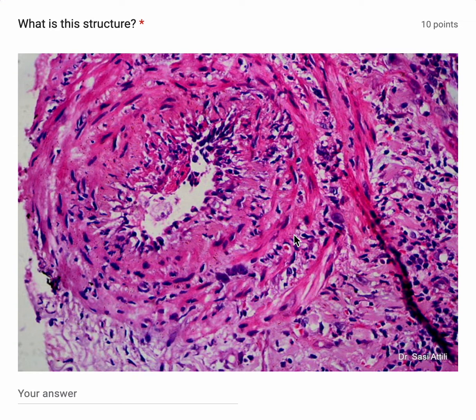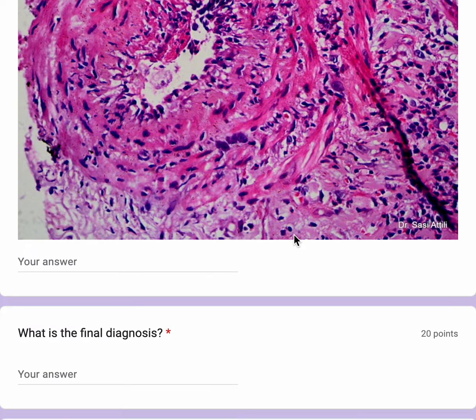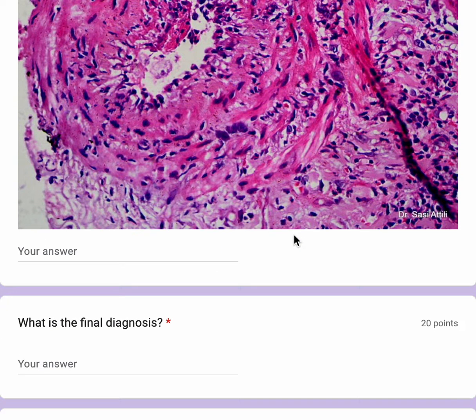All right. Now, based on the clinical presentation, this is cutaneous polyarteritis nodosa. If you say that this is just a medium vessel vasculitis and not polyarteritis nodosa, I would agree. There is no contesting that. Localized cutaneous PAN is basically a medium vessel vasculitis. When there is no systemic involvement, we call this cutaneous polyarteritis nodosa. If you want to call this just medium vessel vasculitis and not PAN, there's no particular objection to that.